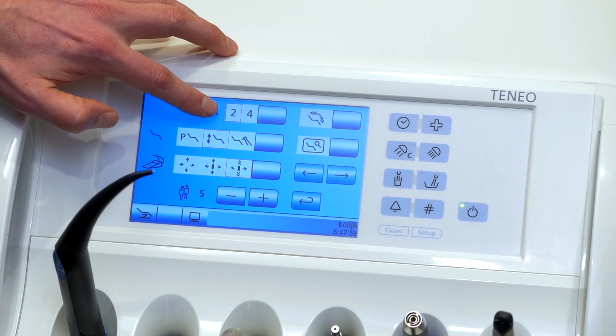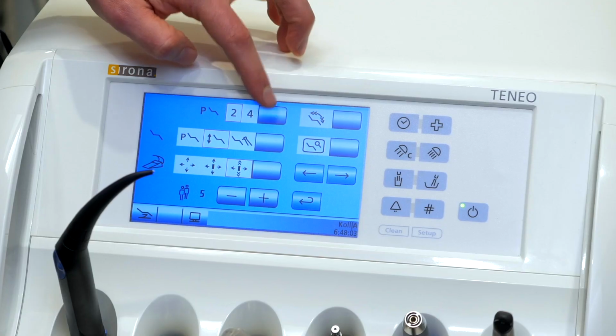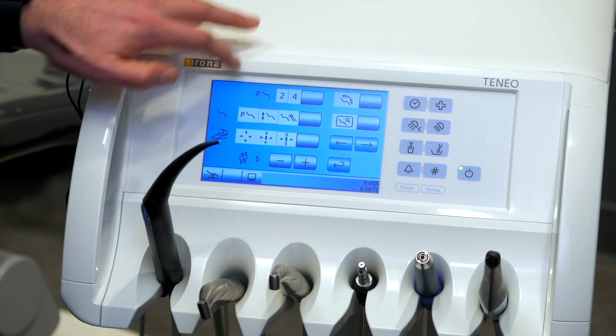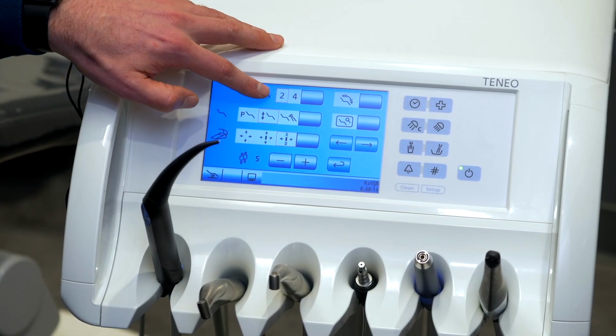In the upper left, you have the number of preset positions. So if I have this on 2, I have S, 0, 1, and 2 available. If I set this on 4, I have S, 0, 1, 2, 3, and 4. That gives me 6 total settings. The most common is going to have that set on 2.